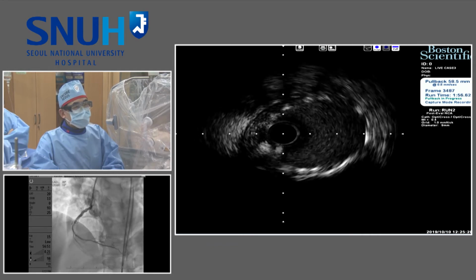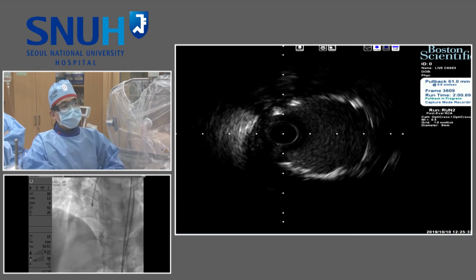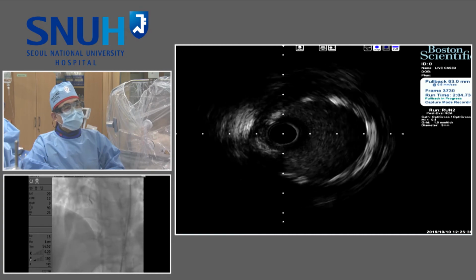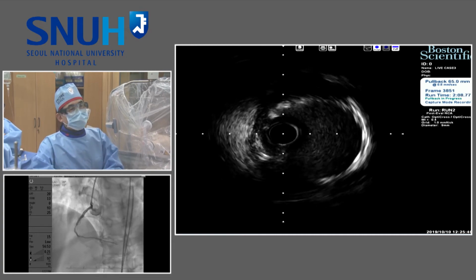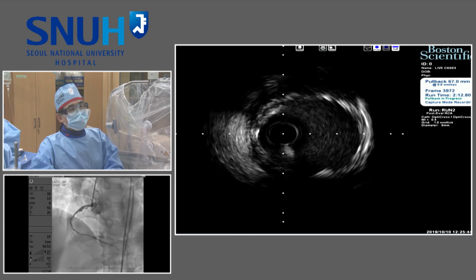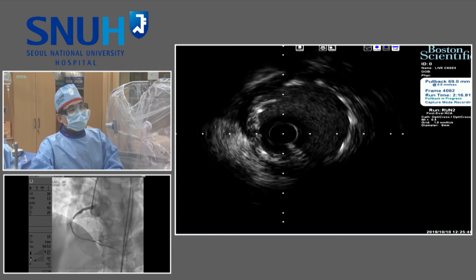So it should be covered. The distal part is a diffusely atherosclerotic segment, and the segment distal to the stent is injured by the balloon or is part of the CTO segment.